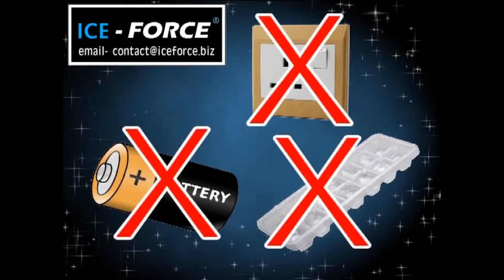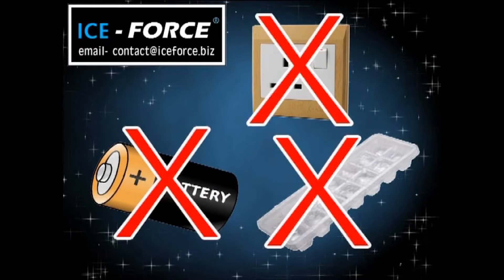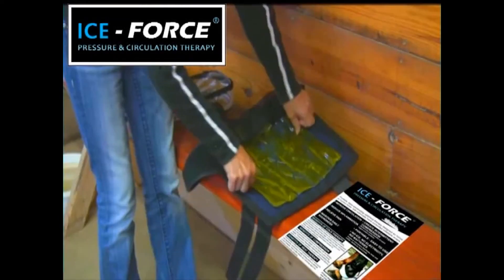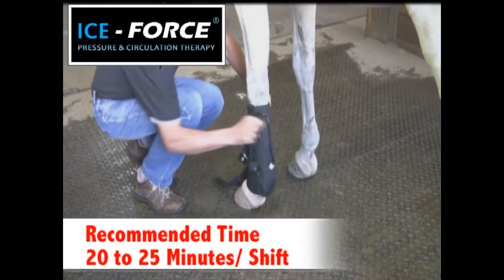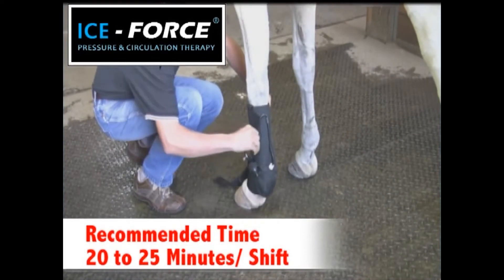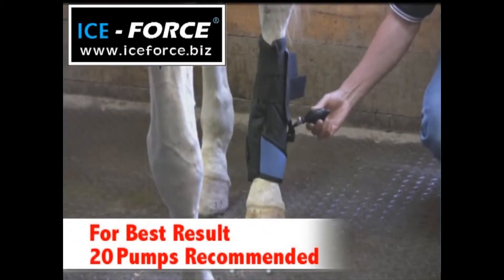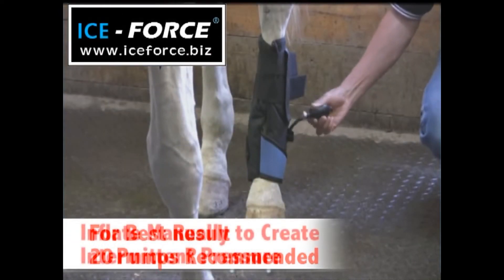No ice, no electricity, and no batteries are required. Simply slide the reusable gel packs into the horse boot and apply smoothly to the leg. The deep, penetrating cool compression will be created by using the manual pump to inflate the boots to the desired pressure, or to create intermittent pressure by pumping and releasing.